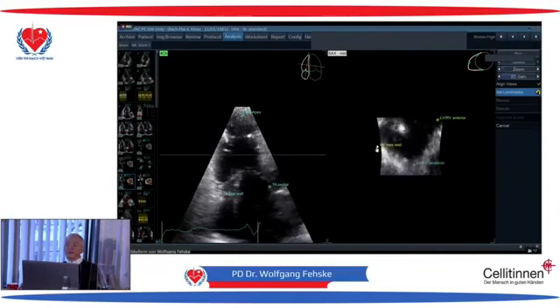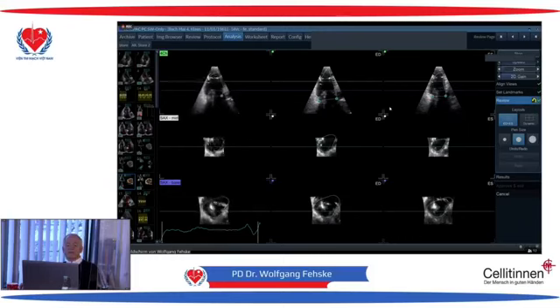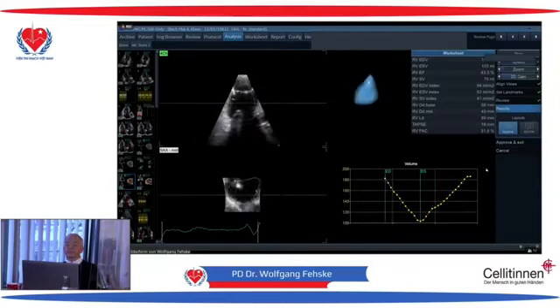So we set landmarks. This is a really huge ventricle, but I am not so unhappy with that, and I will see the results. And this is what you can see now from your side.